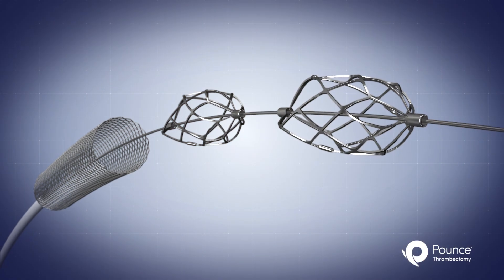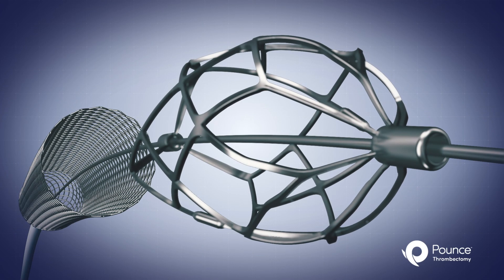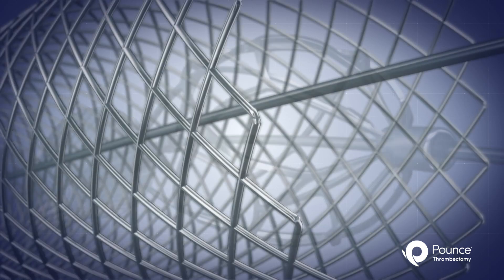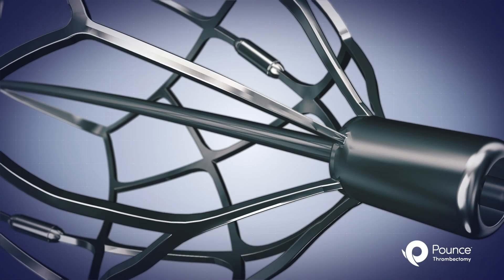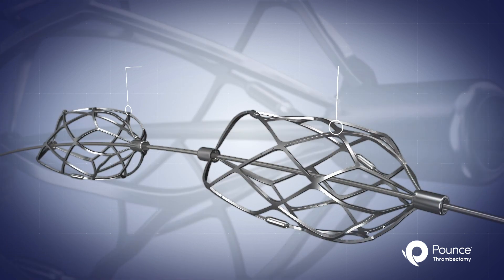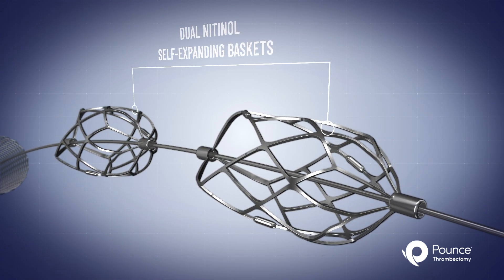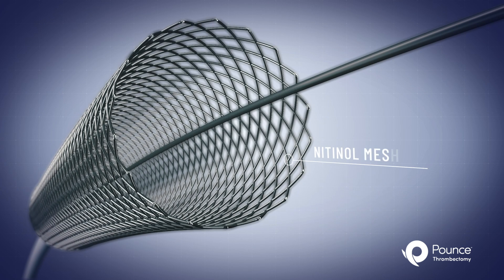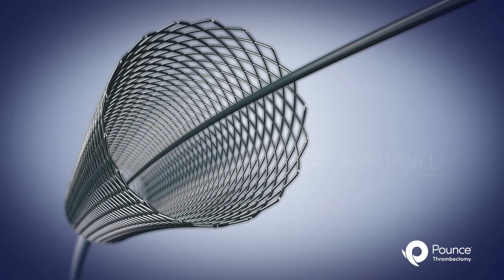The Pounce Thrombectomy System's simple design allows for the quick and easy removal of clot, from acute to chronic, to restore flow without the use of capital equipment. The device is comprised of dual self-expanding baskets designed to retrieve the clot, and a nitinol mesh funnel designed to collect the clot, all within a simple grab-and-go configuration.